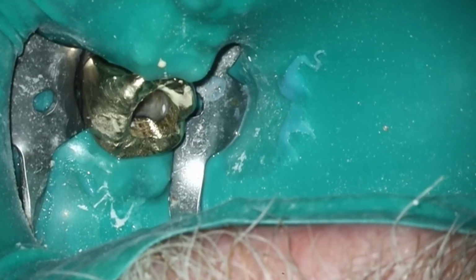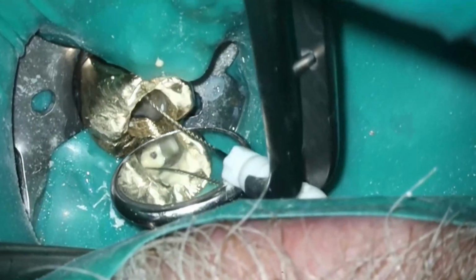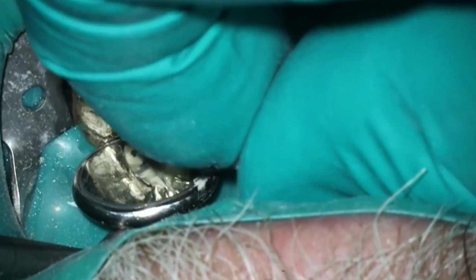And if that doesn't work, the next step is to try different files. So what I'll do here, I believe I go to a 15 next and just kind of go down to smaller file sizes, see what you can do. I do put a slight bend on the file, and that one you can see it's around maybe 18. I think I get it down to about 19-ish by doing the watch winding, but still not all the way patent. You can't see. This is why I don't make hand filing videos, you guys. You can't see anything when it's on a tooth.